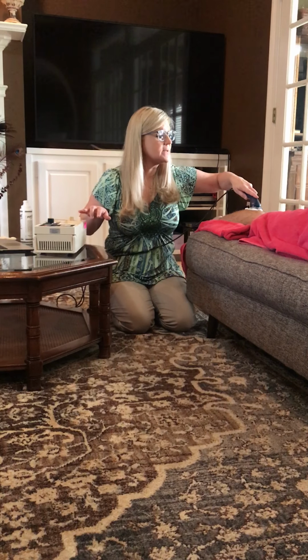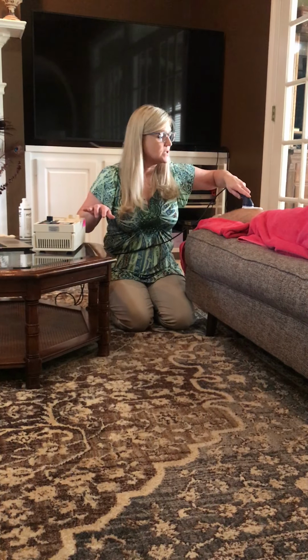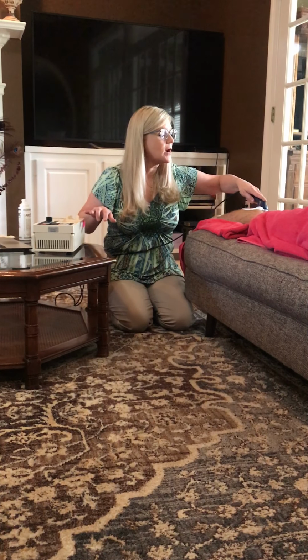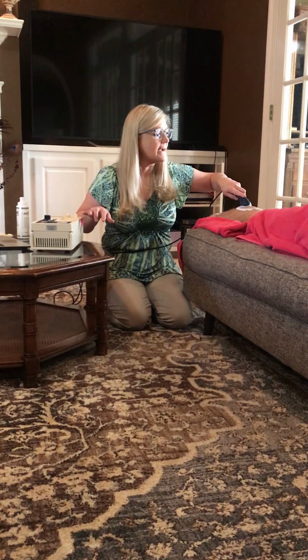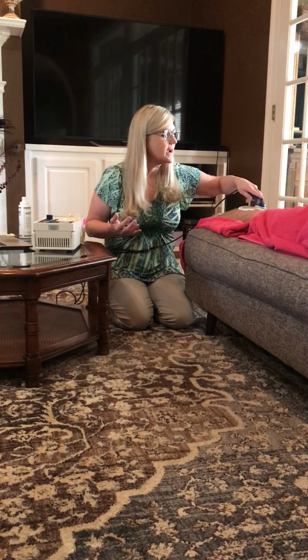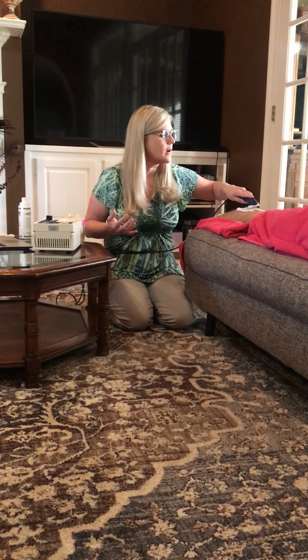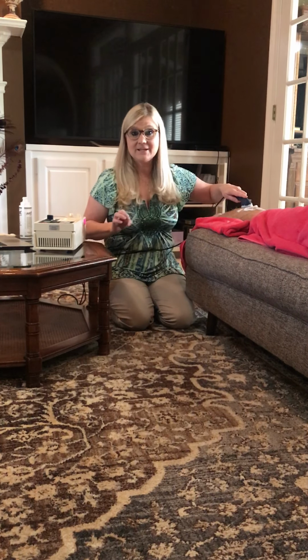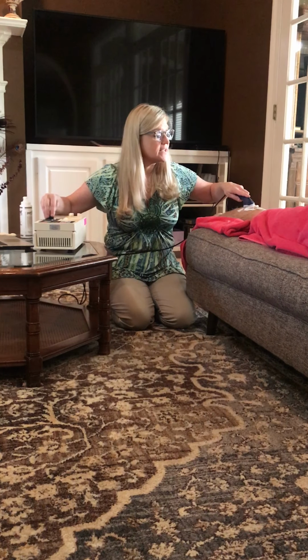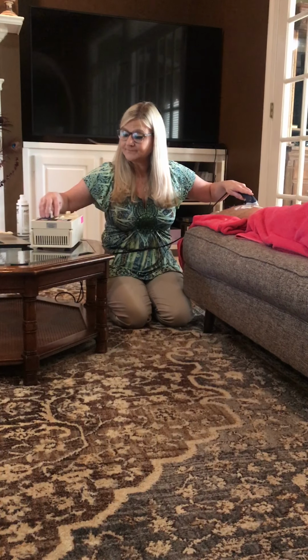We're going to hold it perpendicular to the surface, making full contact. And you can do the circular motion we talked about. You can do a linear where you mow the lawn back and forth. But whatever you choose, you want to go very slow, 4 centimeters per second, and make sure that you're covering every part of the area without going into areas that are not needing to be treated. Okay? So we're going to increase our intensity until he feels a very nice, pleasant warmth.